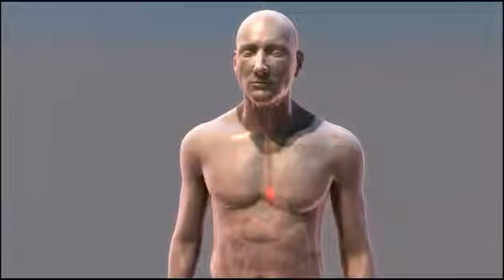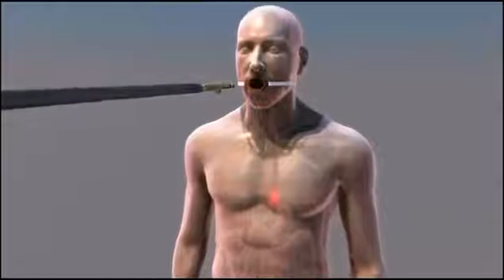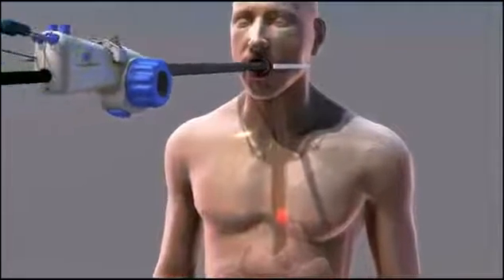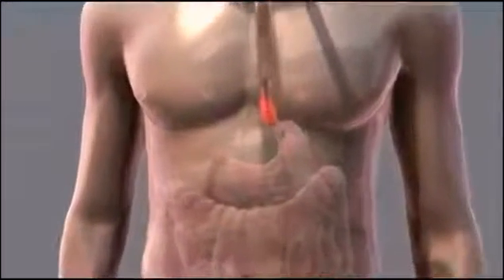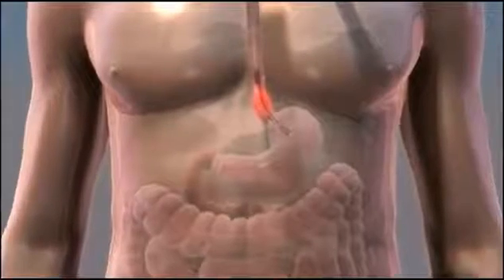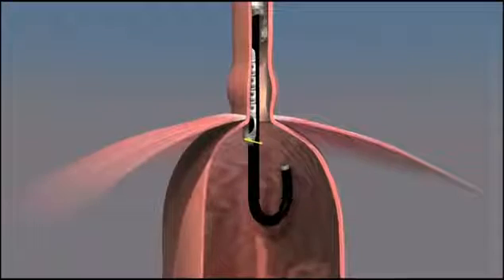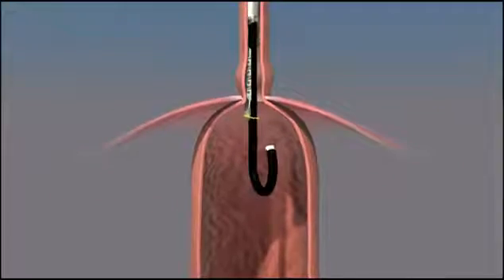TIF is performed under constant visualization by the surgeon. While the patient is under general anesthesia, the EsophyX device riding over the endoscope is gently glided down through the patient's mouth into the stomach. The stomach is inflated and the endoscope is advanced and turned so that it is looking up at the entrance to the stomach. This is where the anti-reflux valve will be created.